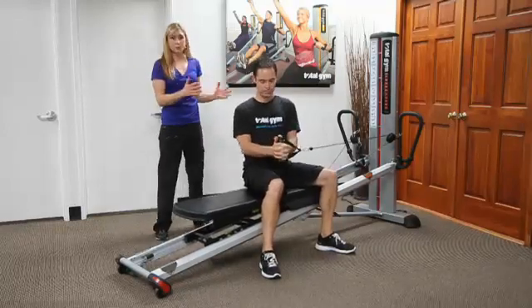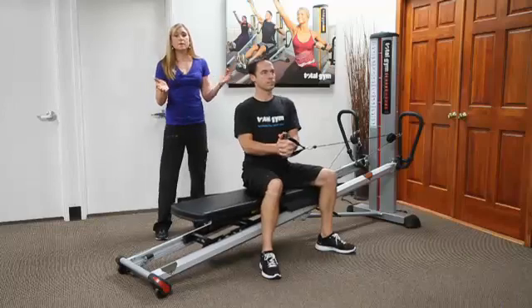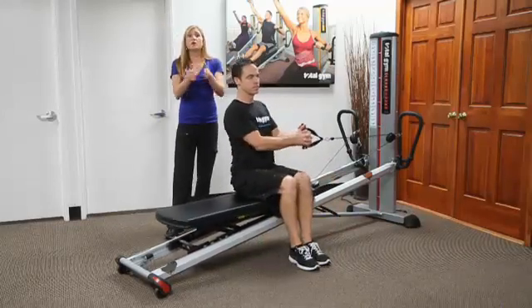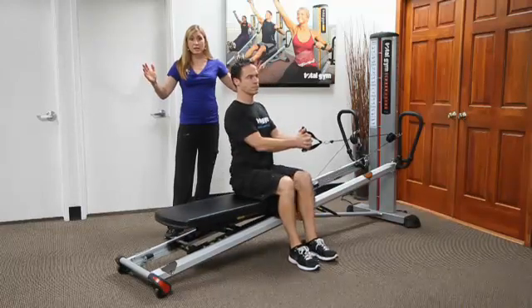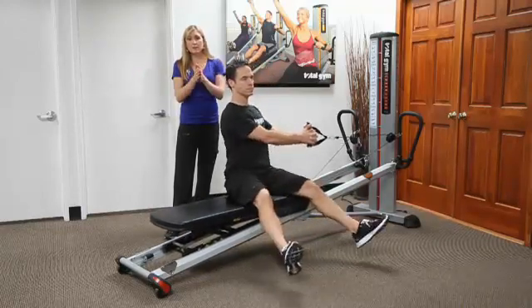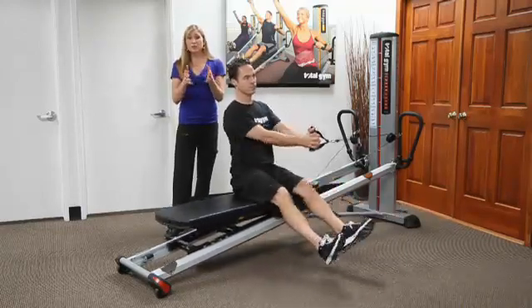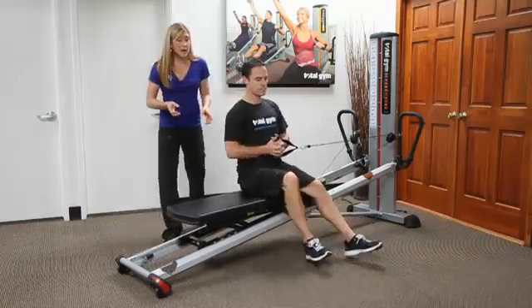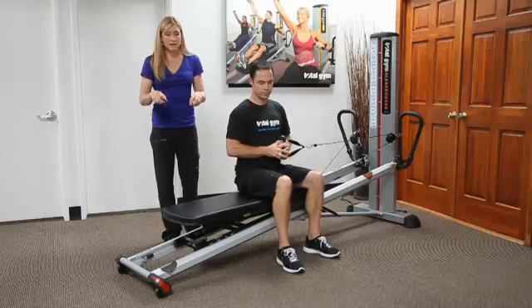They'll just start with a simple torso rotation. Moving from here, you can still go narrow base of support with the legs. And then you can go wide again with the legs, and legs up, and then you can bring them together. But this requires a lot of strength and stability. So for people, what I tend to do is have them sit mermaid or merman.